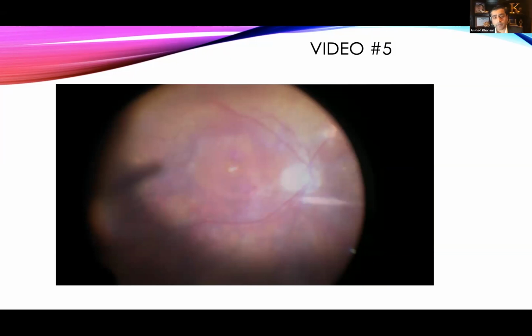No, I agree. I mean, beautiful stain and a beautiful case. I don't really use primary flaps either. Like Mitul, when you and I trained, there were no flaps done, remember? That's why we're not trained on it. This is relatively within the past 5 years or so. And we have great surgeons in attendance, I know Ash Tiwari's here, and Tamir Mahmood, and those guys start pushing for newer techniques for the holes. But yeah, I don't use it for primary.